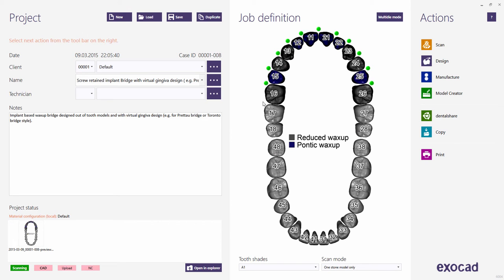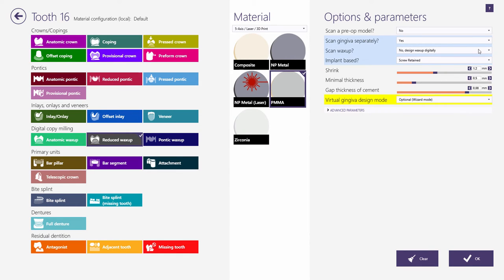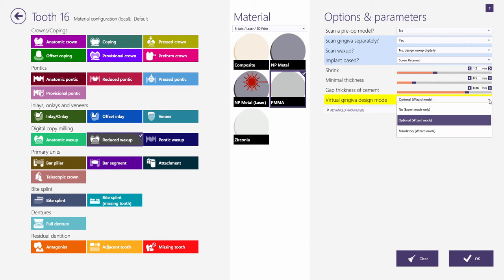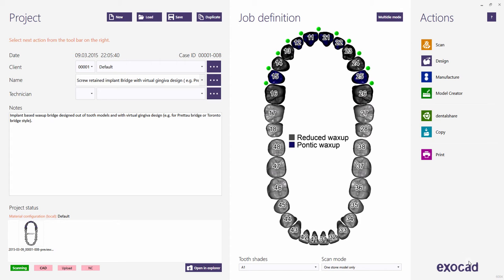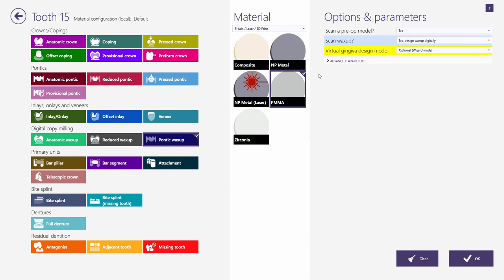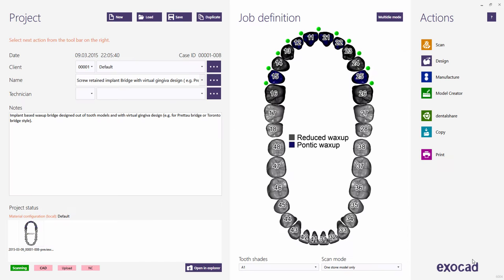Starting with version 2016, there are new options for Wax-Up restoration types called Design Wax-Up Digitally. Furthermore, for all restoration types, there is now a Virtual Gingiva Design mode. The same modes are also available for Pontics. You will find more detailed information about Virtual Wax-Up and Gingiva Design in a separate video tutorial.